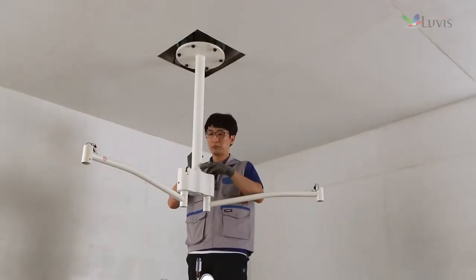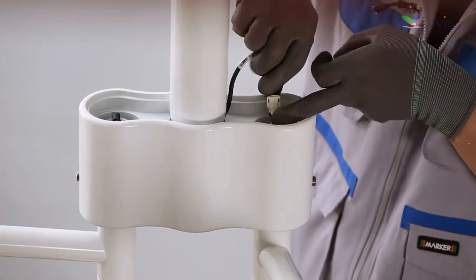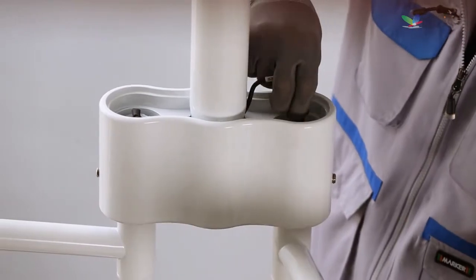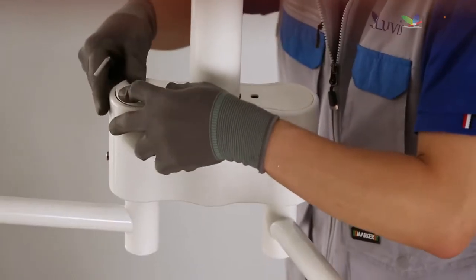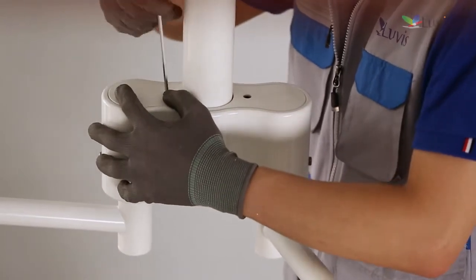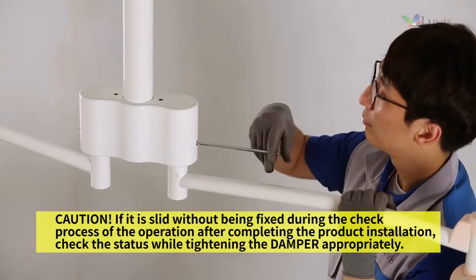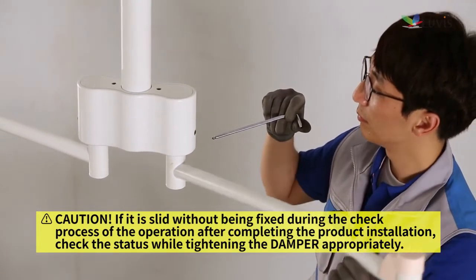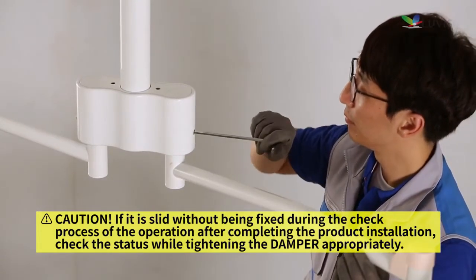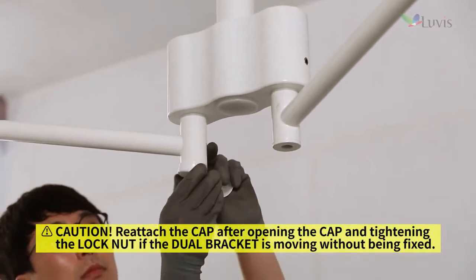Attach the harness connector to the dual ceiling vertical arm harness and the wall second arm. Reattach the dual bracket cover. Attach the damper bolt to the hole on the dual bracket side, then attach the arm housing cap to both sides.